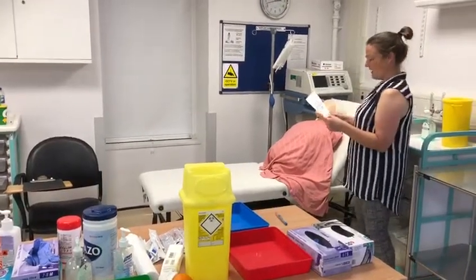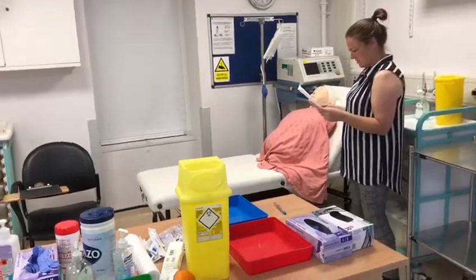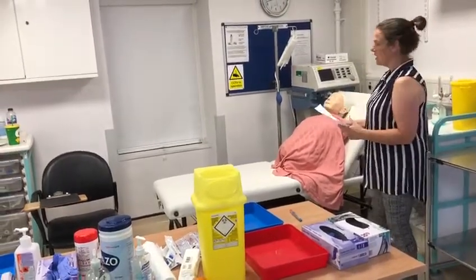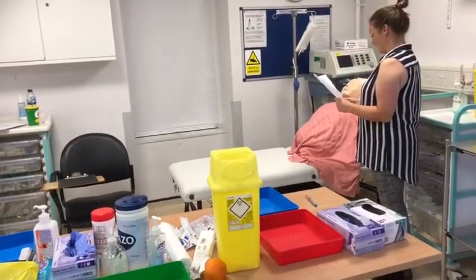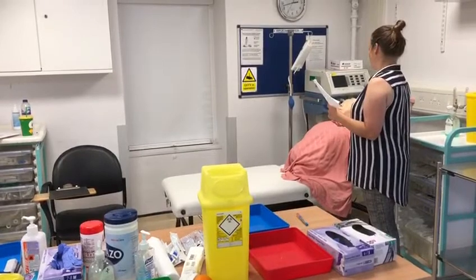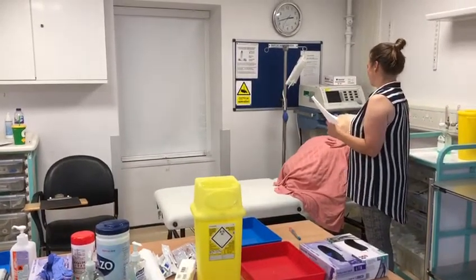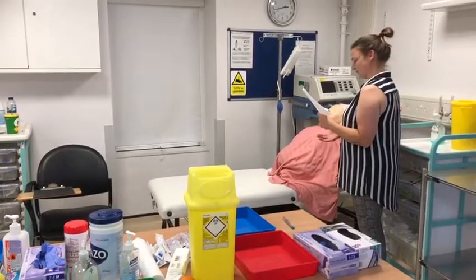And what's your address? Two Longstreet, Northampton. That's correct, I've got that here. You've not got any allergies? No. So it is actually insulin that I've come to give you. And just to doubly check, you've not got any allergies to latex? No I don't. And you don't have any pain or discomfort right now? Not at the moment.